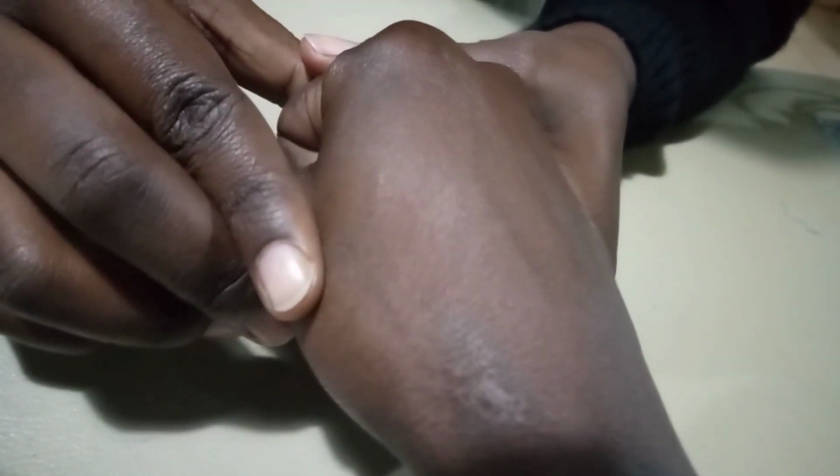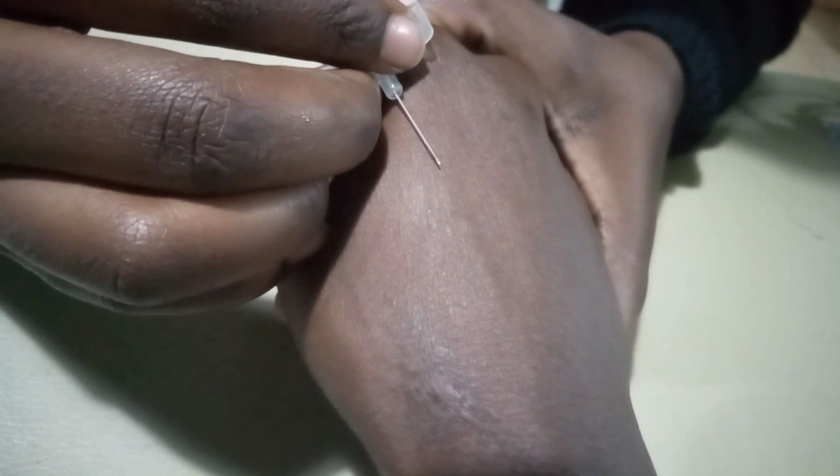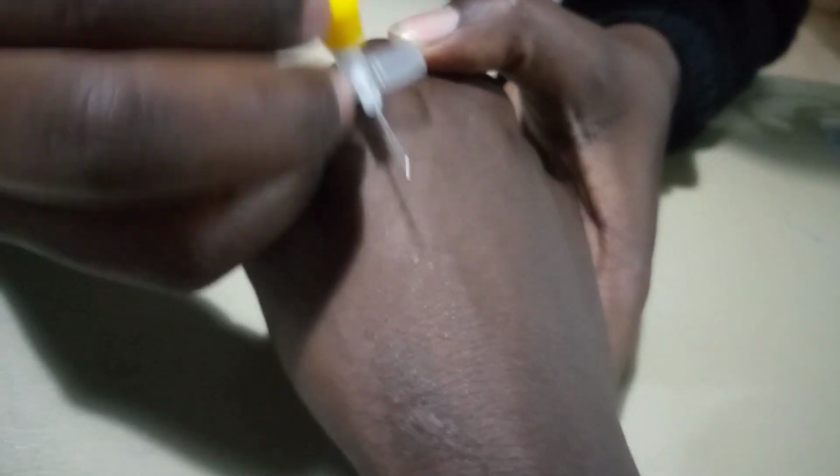If perhaps the vein you've identified is short, which is most common in children and the elderly, you start from far, where there is no vein, as you go in. If you start immediately, the cannula will not enter, or you find there is resistance, like halfway along the cannula, you meet resistance.